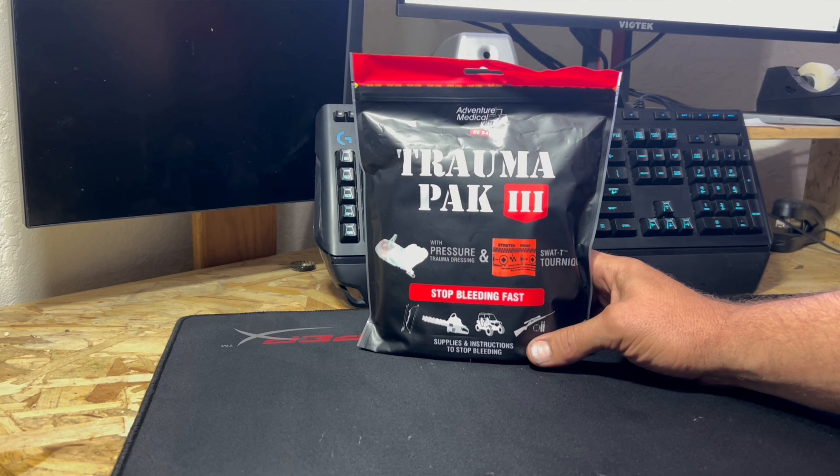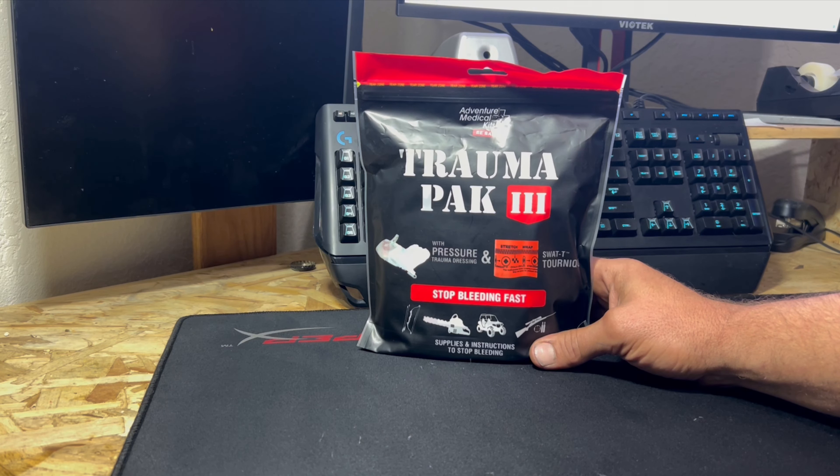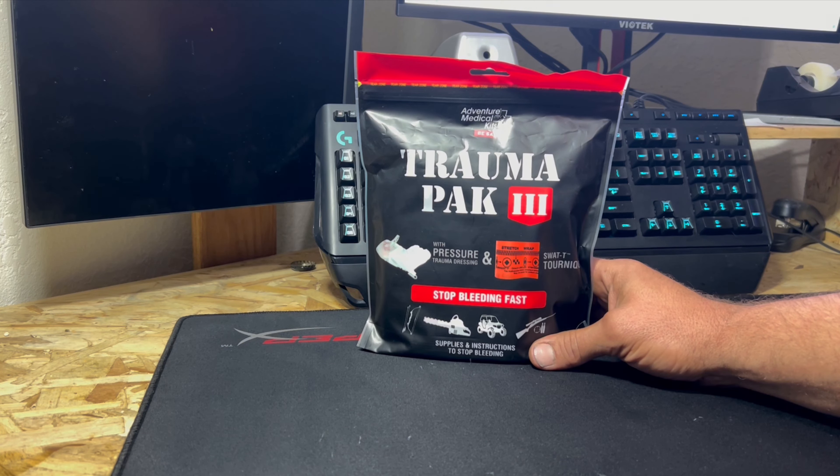Hey everyone. I've got a real fun project I've been working on here that I just have to show you. I've been establishing a large paramedic style medical kit for our family for traveling purposes — whether we're on the road, in the mountains, or anything like that. Throughout that process we purchased a few pre-packaged items thinking they'd be a great value, but after purchasing them I decided I needed to do something about it.